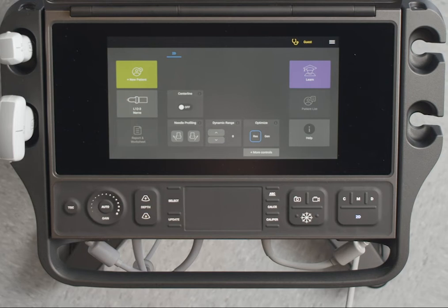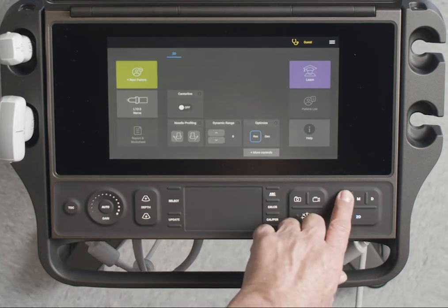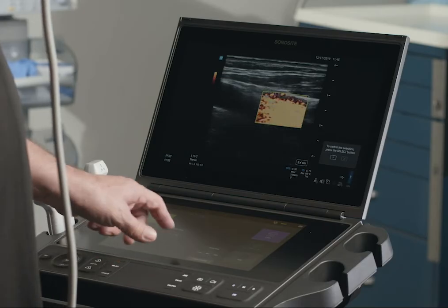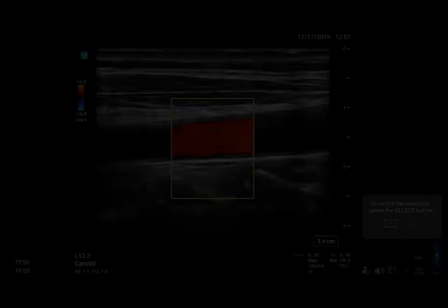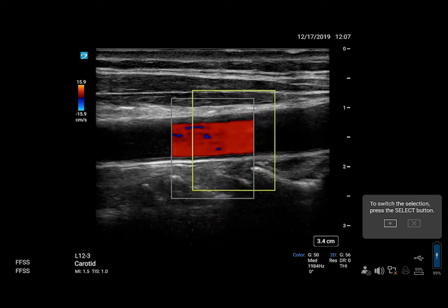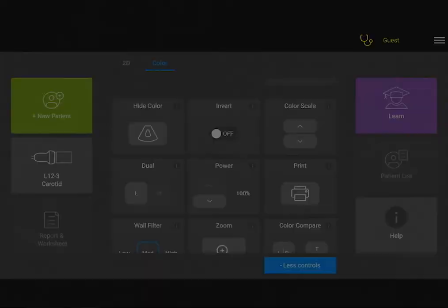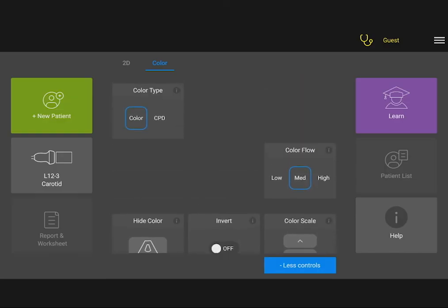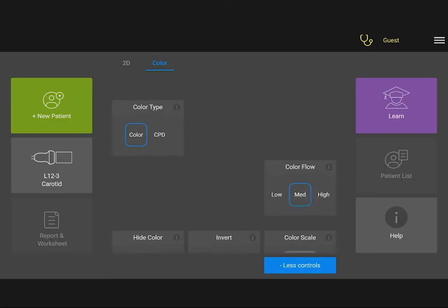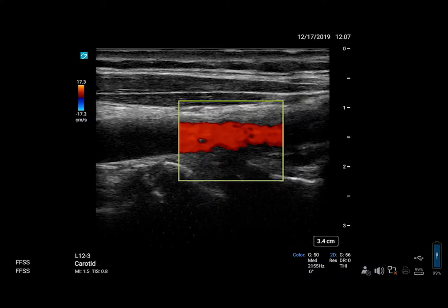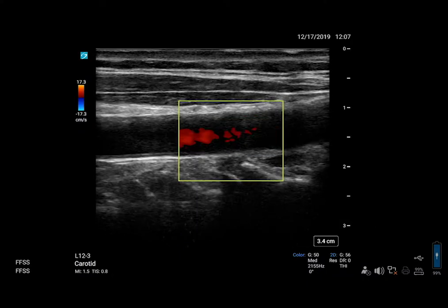Let's go back to 2D to look at color. Press C, then you can adjust the color parameters such as box size and placement. To change to Color Power Doppler, tap CPD on the Color Type Control. You can use CPD to detect very low levels of blood flow.